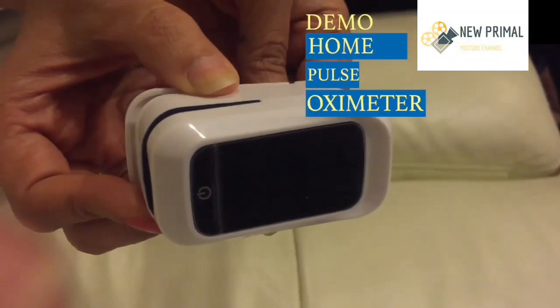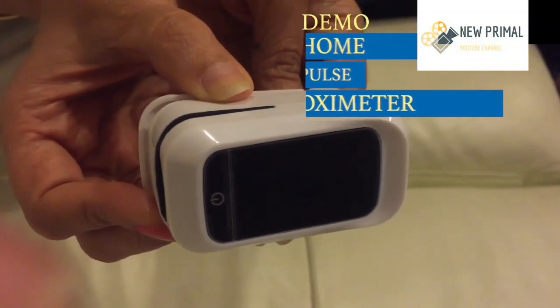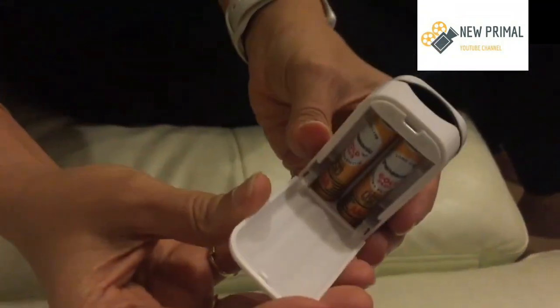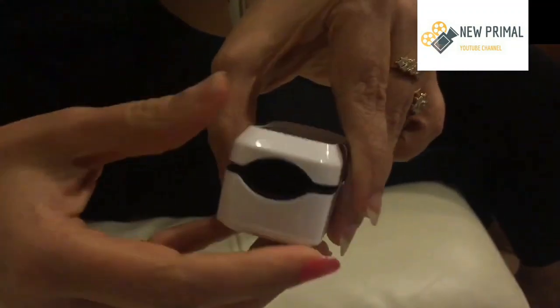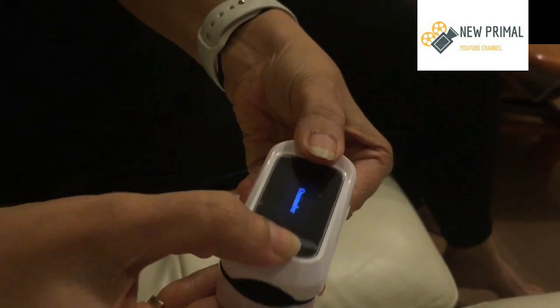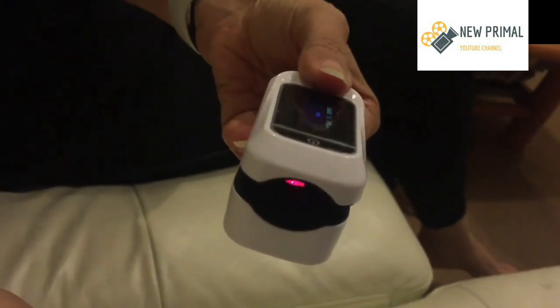This video will demonstrate the use of a home pulse oximeter. This is the machine — it's battery operated and has a battery chamber at the back which houses two triple-A batteries. It opens like a clip.